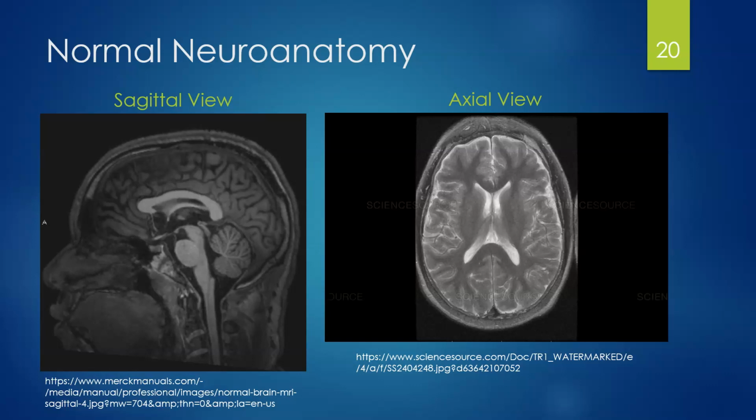There's no weird changes within the tissue itself. Nice, clean central brain and midbrain. Getting into the hindbrain. Cerebral spinal fluid seems consistent and normal throughout. Shape looks normal. There's no weird voids. Okay, and then same idea here.